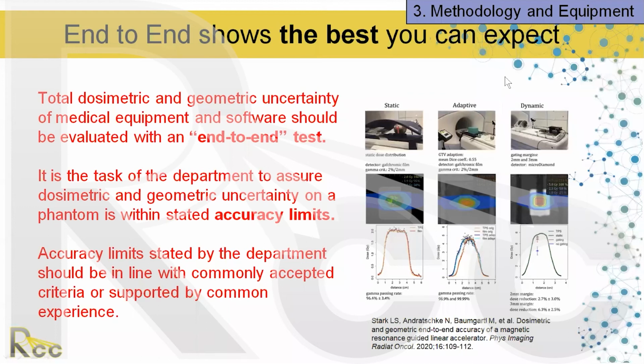It's a very standard periodic motion. So again, these are idealized. Phantoms are still phantoms. They're not humans. If you're going to be employing some form of deformation, there are phantoms that can do that, but it's not the same. So this is the best you're going to get with your end-to-end.